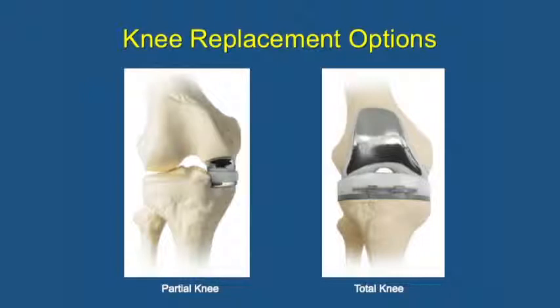No doubt about it. And the second thing is that piece of plastic here slides back and forth on that tray. It slides in and out. It moves, it glides. Whereas here, this plastic's locked in place. And in every other partial knee replacement, the plastic locks in place to the tray. So this particular surgery is a little bit harder because you have to balance things just so that piece of plastic doesn't spit out since it's not locked in. So it's a little bit technically more demanding, a little bit more artsy, if you will.